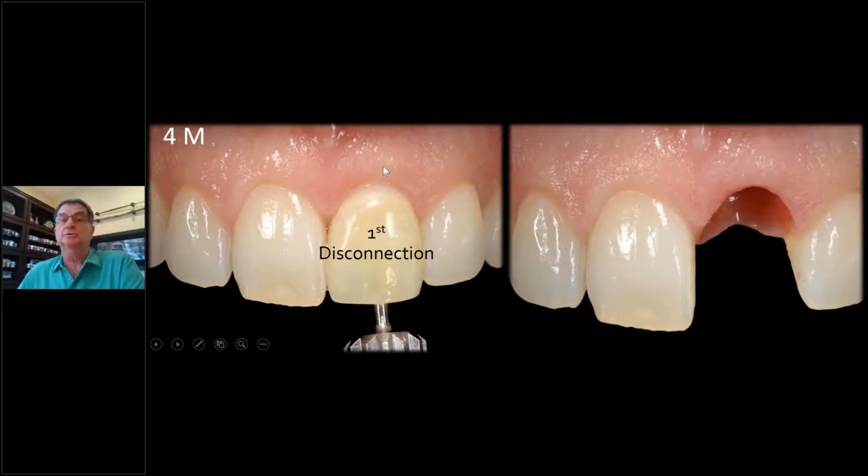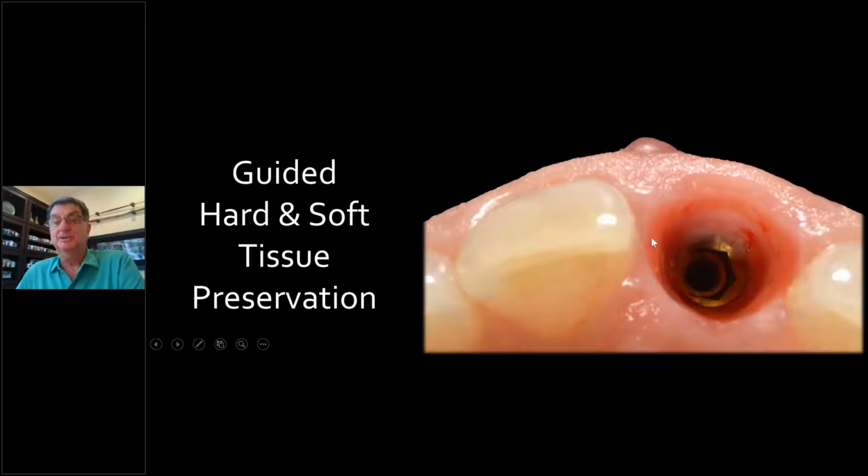And there's the beautiful tissue, and there's what we see. Now, when we take it off, we sometimes see bleeding, and that's actually good. We published on this. Won't have too much in the short time we have. Won't go through too much of this. But when you see bleeding, that means the epithelium actually adhered to the temporary.